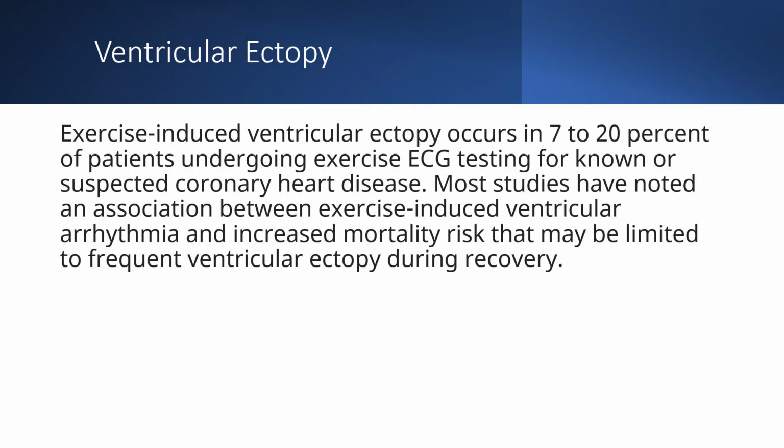PVCs occur commonly, however they should decrease with exercise. If PVCs increase in recovery, they are considered to be high risk findings. Alerting the interpreting physician and including that in the preliminary report is quite meaningful and helpful.